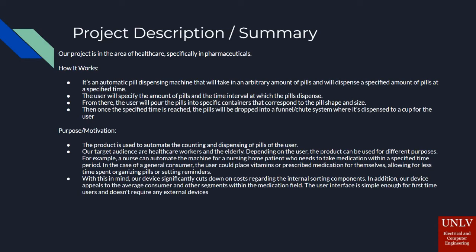So here's our project, the Automated Pill Dispenser. Our project is focused in the area of healthcare, specifically in pharmaceuticals. So how it works is that it's an automatic pill dispensing machine that will take in an arbitrary amount of pills and will dispense that amount of pills at a specified time.